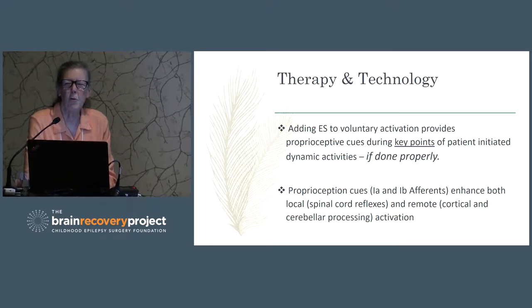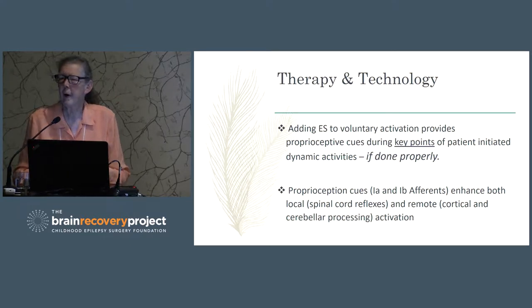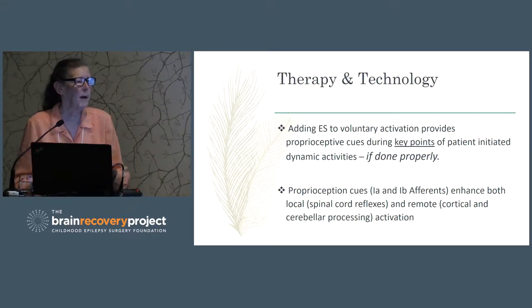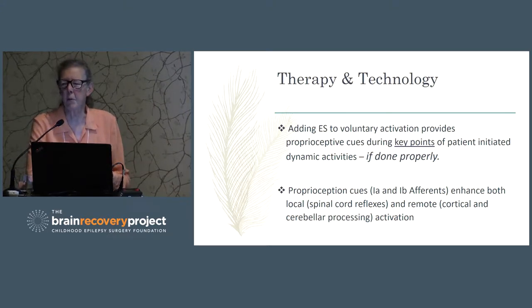When we add electrical stimulation to any kind of voluntary effort, and this is true in individuals who would be considered motor control normal, or individuals who may have a neurologic impairment in their motor control, we are increasing the sensory drive on those motor neurons and making it easier when the patient tries to recruit the motor neurons. The motor neurons are already excited. So the thresholds have dropped, it's more easily excited. And so people who have marginal descending control and can't do a whole lot, if you use stimulation either as a primer or as an active ingredient of the treatment program, then you can make it much easier for your children to be able to activate the system on their own.